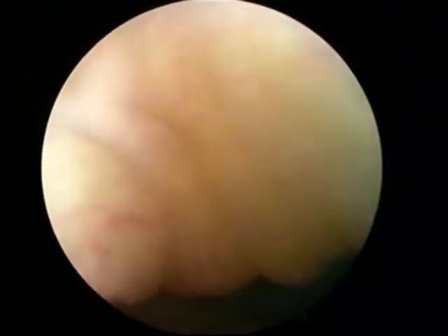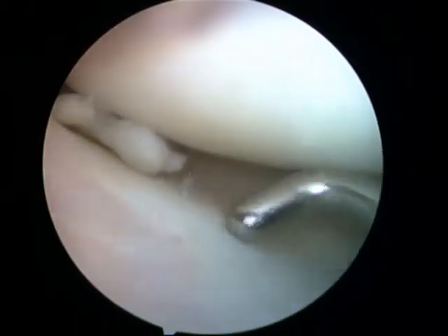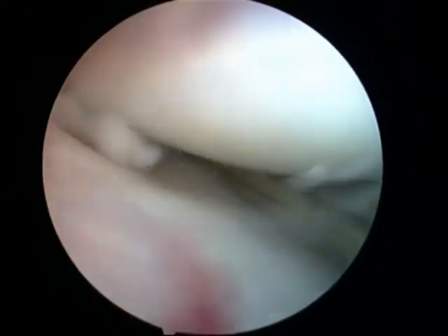To the left I have got a tear under there. He's just trying to get to it and they move my leg. There's a bit of cartilage there that he's got to cut off — they're trying to get that tool in there and move my leg at the same time to give him better access to cut it off.